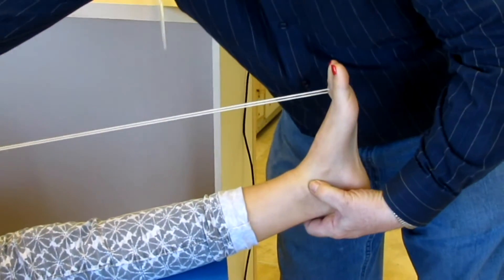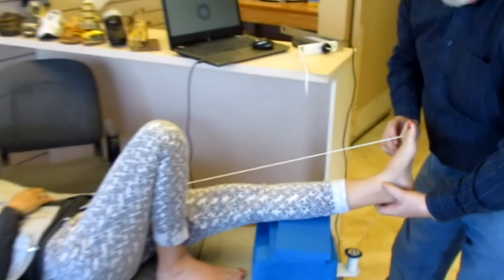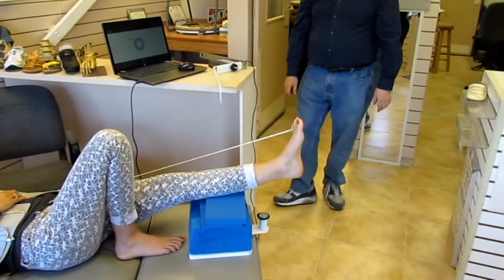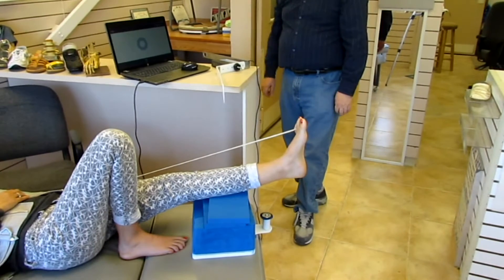We're zooming in on the patient's foot. Mr. Arch just handed the patient a string. The foot doesn't even move. It's perfect positioning. And we have the patient's foot in subtalar neutral.